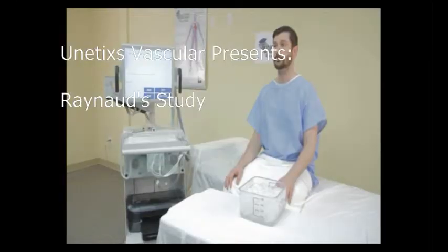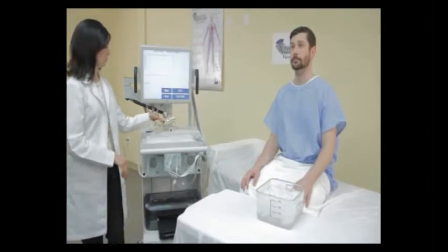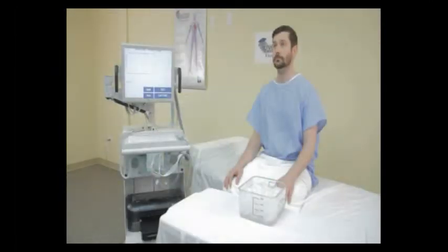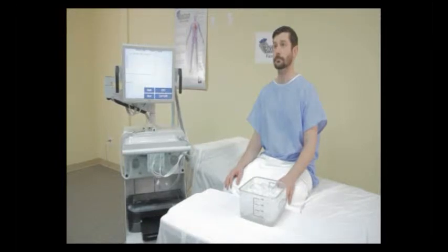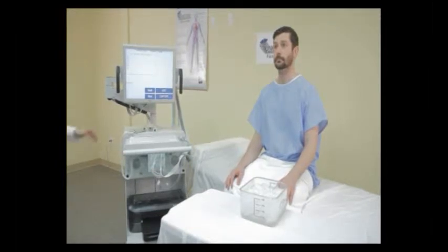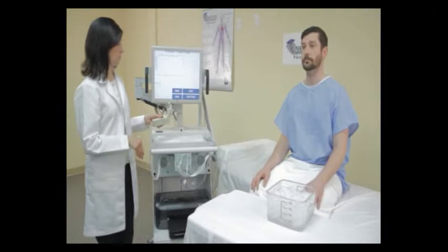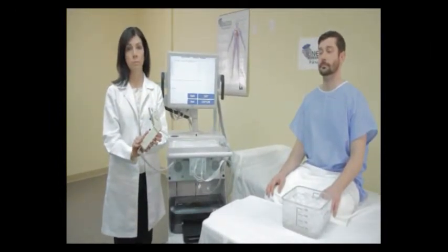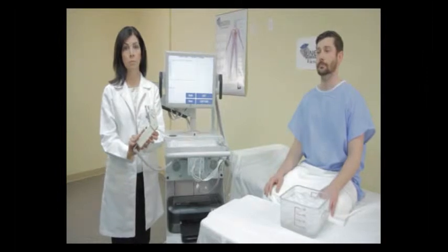In this video, we're going to demonstrate performing the Raynaud study using the UNETICS infrared temperature sensor. The problem with other methods of performing this exam is that they involve handling the digits after the ice water immersion. With the UNETICS temperature sensor, the hand is not touched by other hands, room temperature sensors, or cuffs.